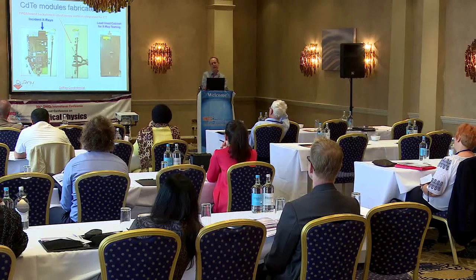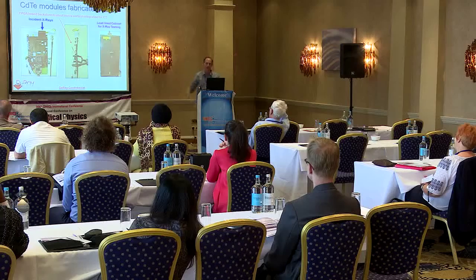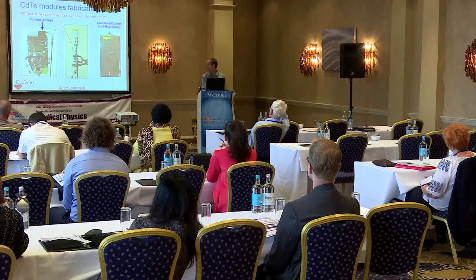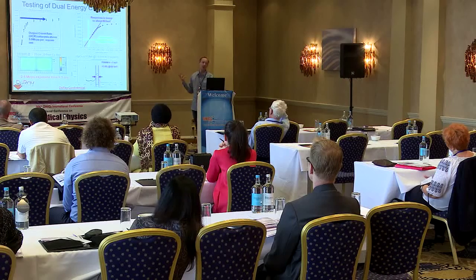And then here you can see a digital readout system is used, which is vertically integrated underneath the sensor area. So both the ASIC has to be vertically integrated underneath the sensor and a readout system as well. So looking at an edge view here, you can see by achieving full vertical integration of all of the electronics, you can then tile many, many of these modules together to create the fan beam geometry that's used in CT. These detectors are first tested in an X-ray cabinet before being used in a system to image patients, for example.